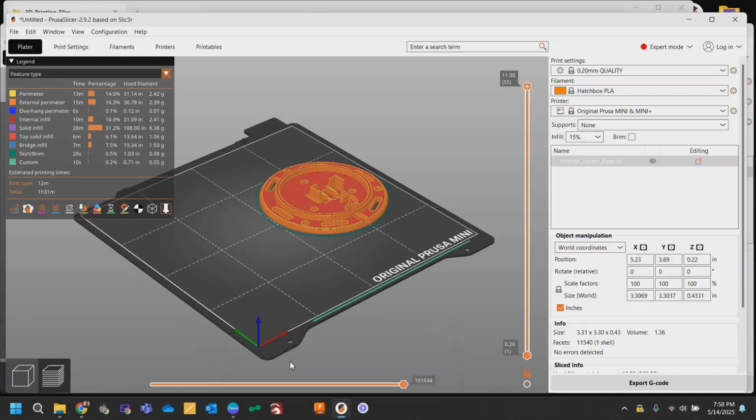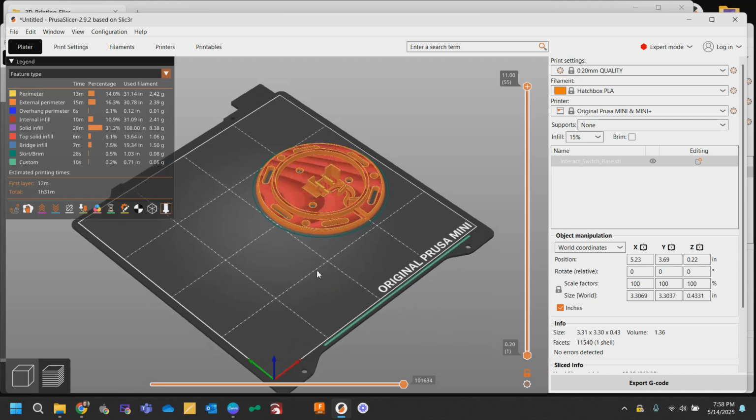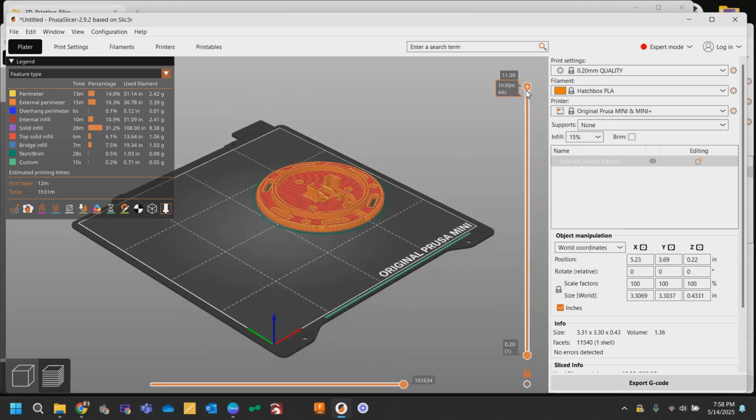Once you have sliced it, it looks like this. It's going to show you the sliced model. Well, that literally does slice that 3D model into hundreds of layers, and it tells your 3D printer how to start at the very base and start adding one layer at a time until you have completed your print.